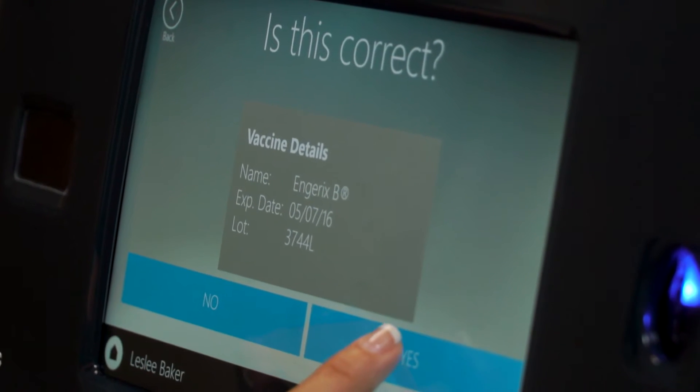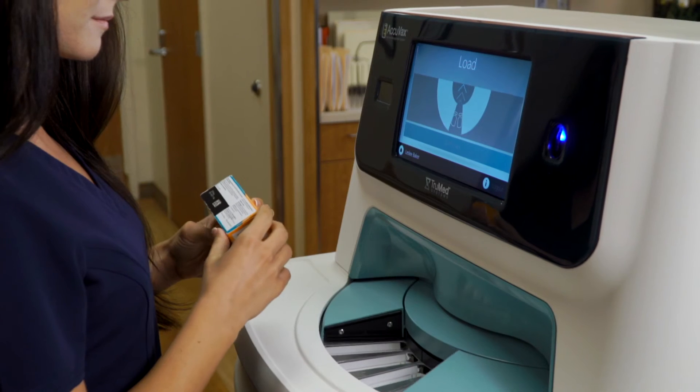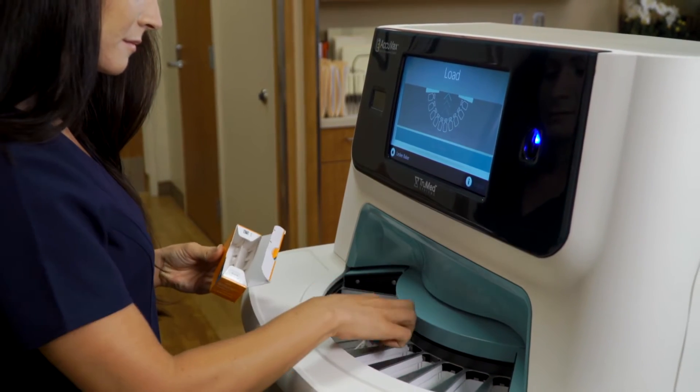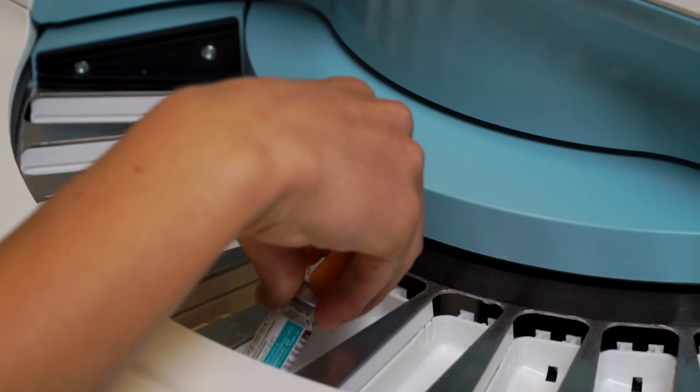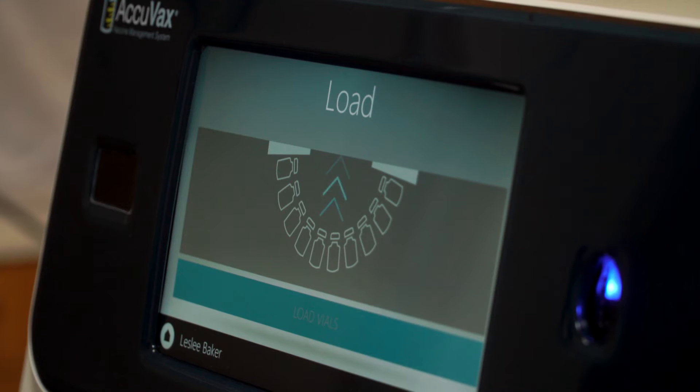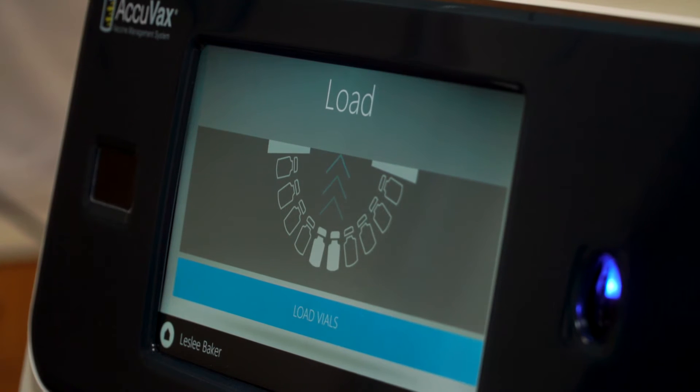Confirm the details using the touch screen display and prepare the vaccines for loading into Acuvax's purpose-built environment. When placing vaccines into Acuvax's tray system, Acuvax's display lights up to indicate which slot the vials have been placed in.